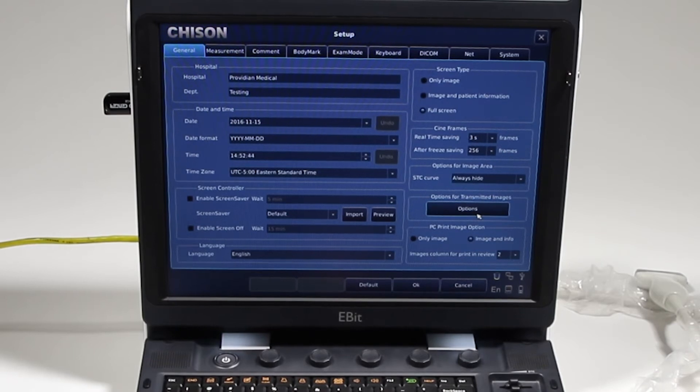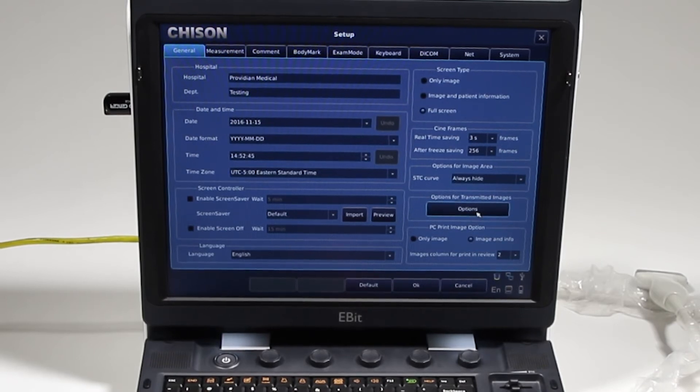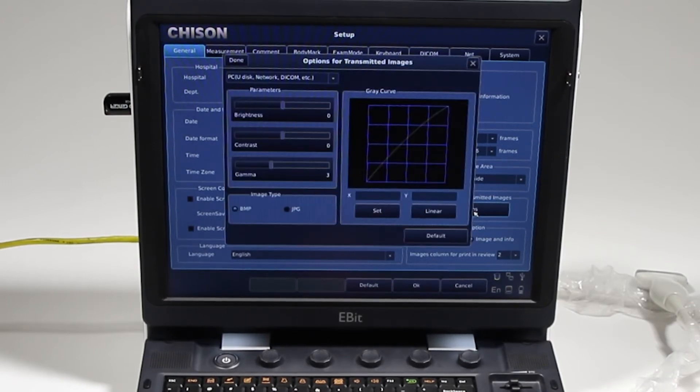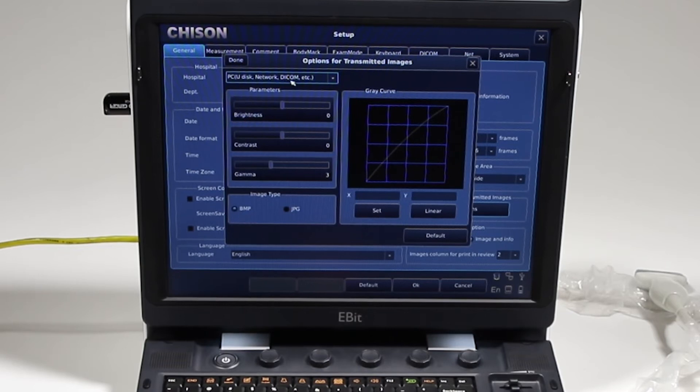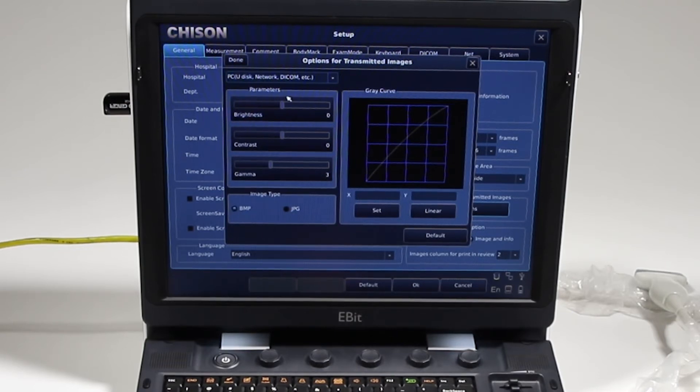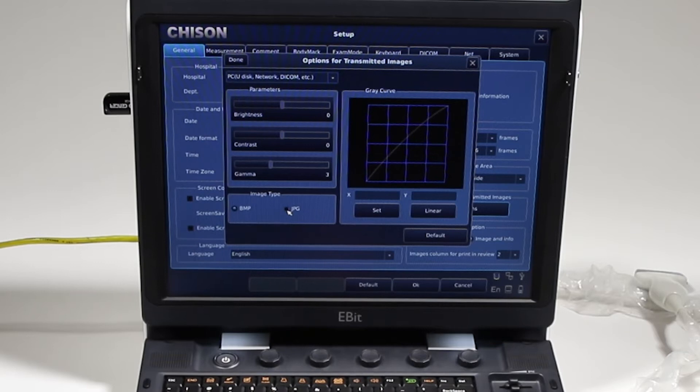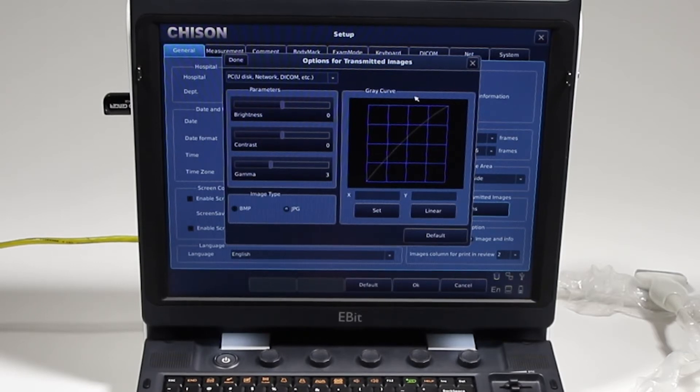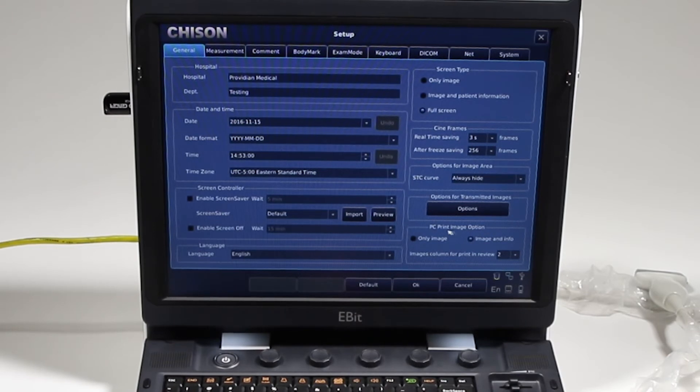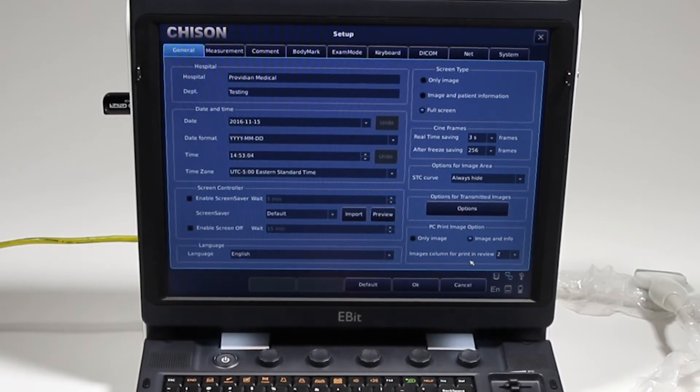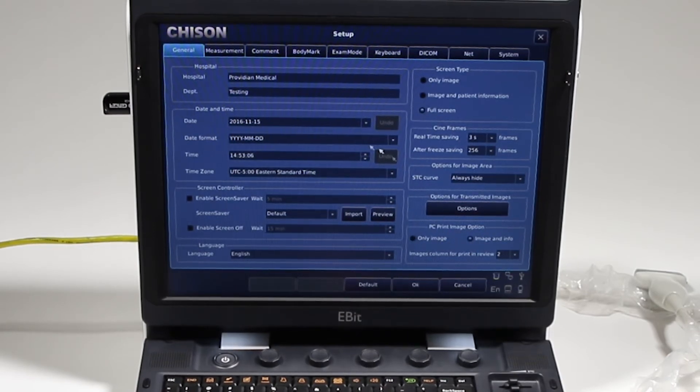Options for transmitted images: if your images are showing up too dark, you can go ahead for this DICOM and whatnot. For U-disc, if it's showing up too dark, you can increase the brightness contrast for how it is exporting if you don't like how it's being done. Same thing PC print: if you go to a PC printer, it's going to say what is it that you want to see.